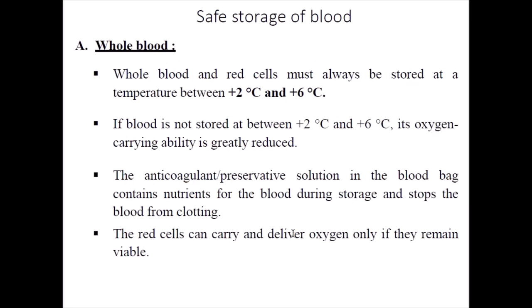For whole blood and red blood cells, the storage temperature is between 2 to 6 degrees Celsius — normally stated as 4 plus or minus 2. If not stored under this range, the oxygen-carrying capacity is greatly reduced. The anticoagulant or preservative solution in the blood bag provides nutrients and prevents clotting during storage. Red blood cells can carry and deliver oxygen only if they remain viable.